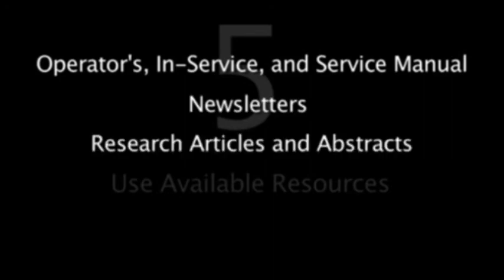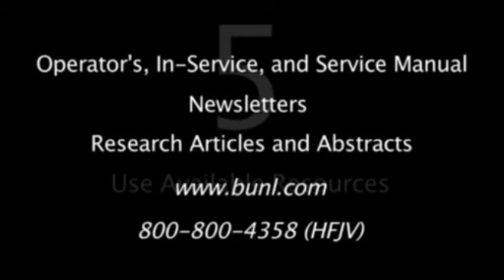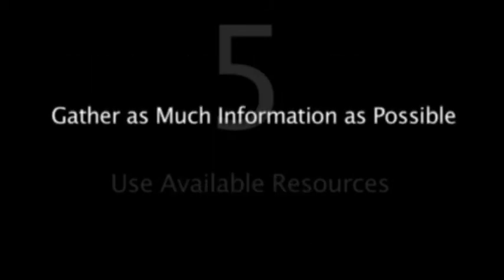Fifth, use available resources. Bunnell Incorporated offers an operator's manual, an in-service manual, periodic newsletters, research articles. We have a tremendous website full of information. And, of course, we have the 24-hour hotline, which is 800-800-4358. When using the hotline, make sure to gather as much information about the alarm condition as possible. The more facts you have about a situation, the better we'll be able to assist you when you call the hotline.